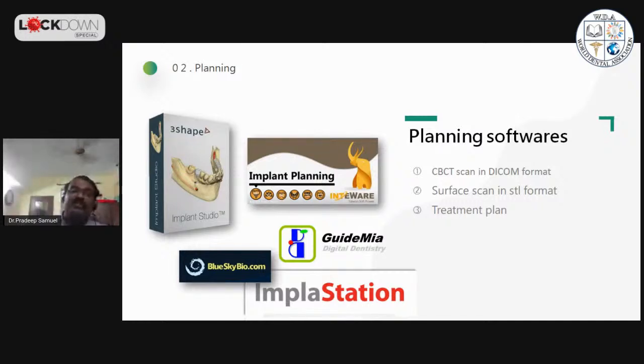So for any software for that matter, we need 3 data presently to plan this. One is your CBCT scan in the DICOM format. The next one is your surface scan, that is STL format, that is nothing but your intraoral scan, or the models which are sent to the lab, which you get in the STL format. That we call a surface scan. That is the second data we need. The third data is the treatment plan. We need to arrive at a treatment plan. Either the dentist is planning it, or if the lab is planning it, we need to send the treatment plan to them. So these are the 3 mandatory data to go for the planning software.